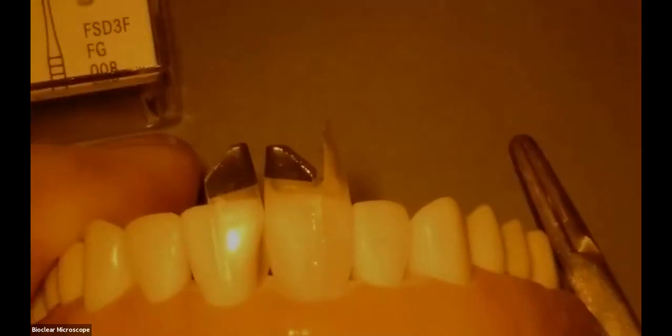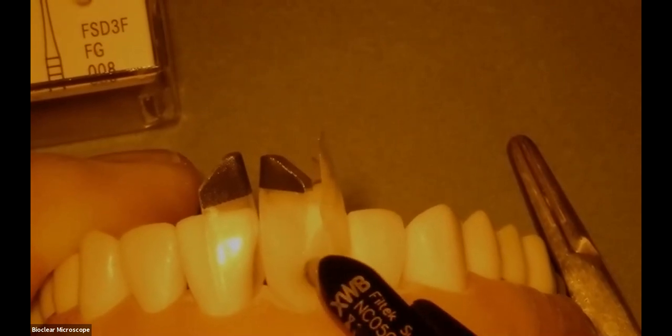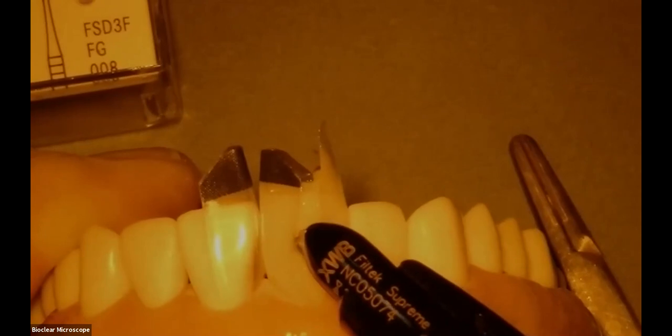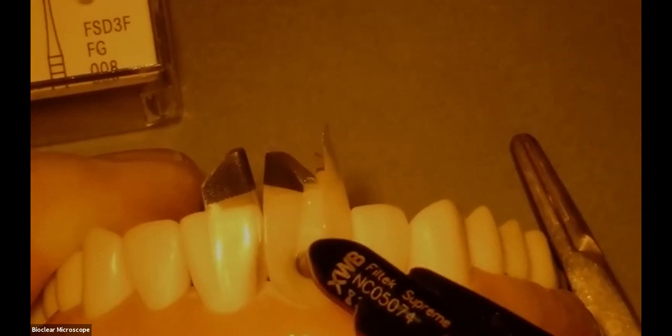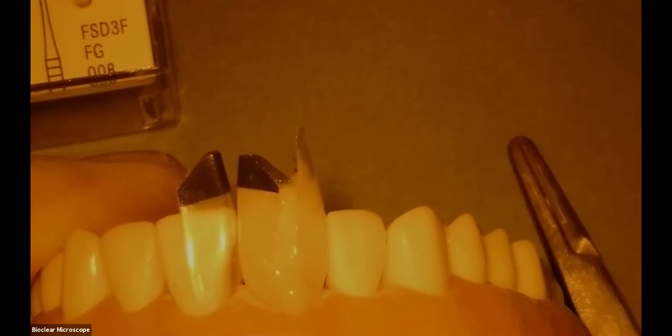The last thing I'll do is to bring in my heated paste composite. We're going to push the matrices apart and start injection molding. My compule is about a 1/2 millimeter off the tooth. We're going to push the paste in like so. You'll notice that the matrix is doing a beautiful job of containing the composite. I'll use the neighboring tooth as a reference.